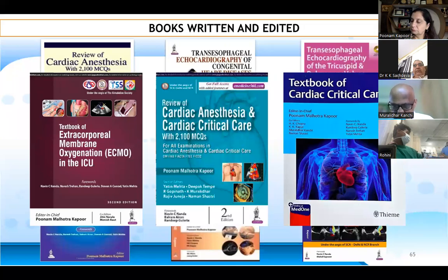I remember one case of pericardial lipoma. It's a rare condition. But intraoperatively, we found that it was not just pericardial, it was intramyocardial. And in fact, while dissecting it, an LV hole was made and urgently we had to go on CPB. So all these things we can monitor and warn the surgeons on table also. So there is a role for echo, especially in the perioperative period. This was my comment, sir.